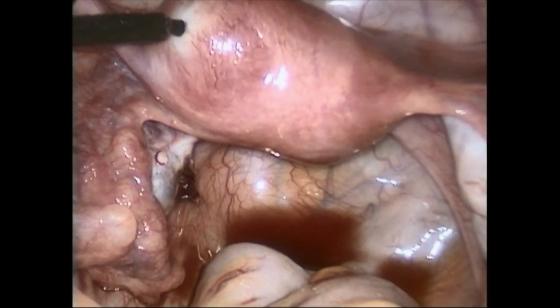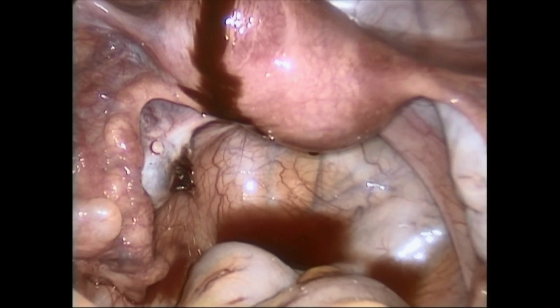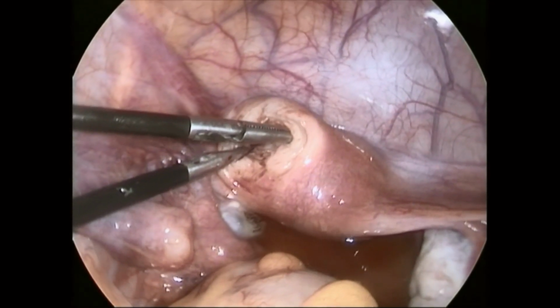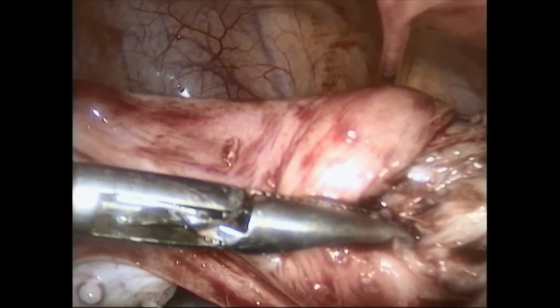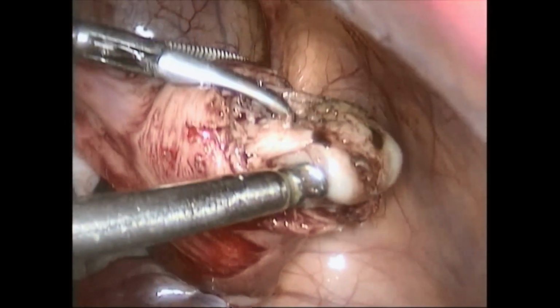You can confirm it by putting in an aspiration needle, and the menstrual blood collected in that cavity spills out. Just make an incision, enucleate the cavitary mass, and you can suture the uterus afterwards.